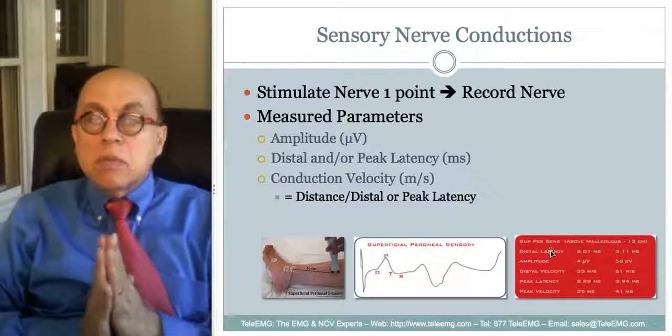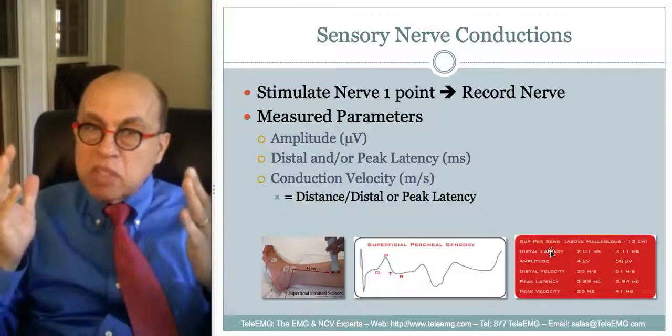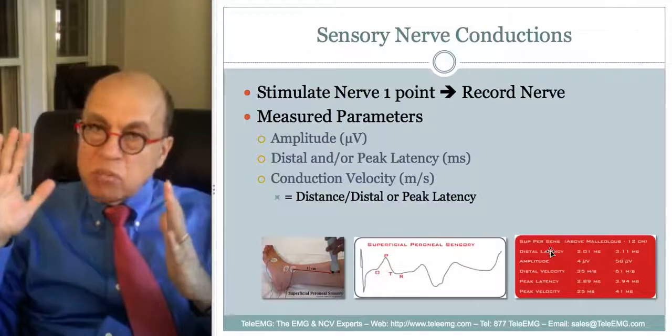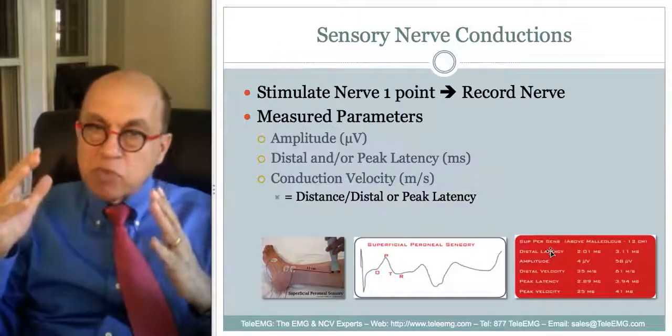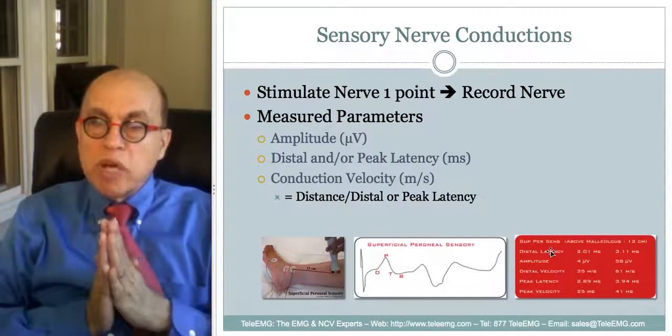So, now we're going to come to the lower extremity. The principles of sensory and motors are the same. They also have F responses, but in addition, they have the H reflex, and I'll tell you a bit more about it.